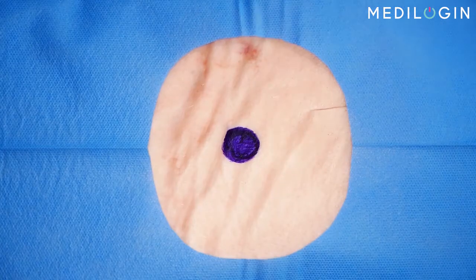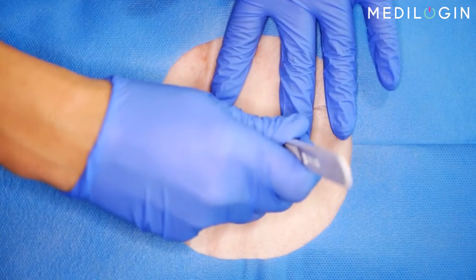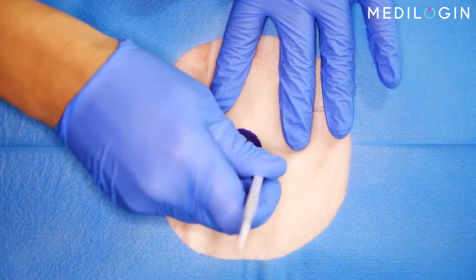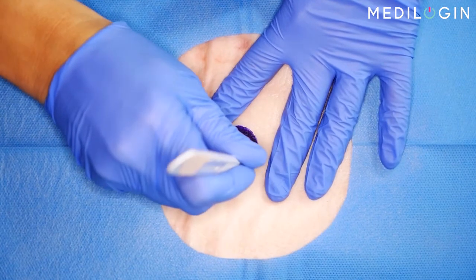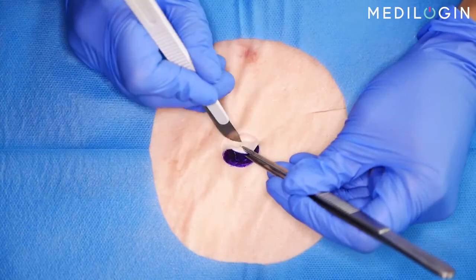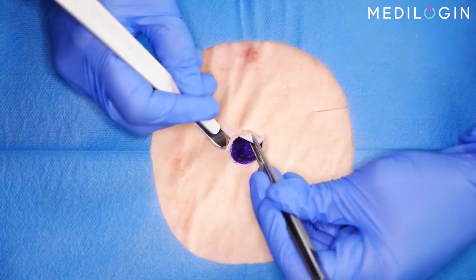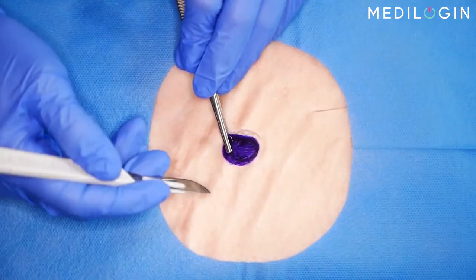Here you can see the skin defect to be excised. Tauten the skin with the left hand and carefully excise the defect with the tip of the scalpel. Then use the anatomical forceps and separate the dermis from the subcutis. The tip of the scalpel is also useful.